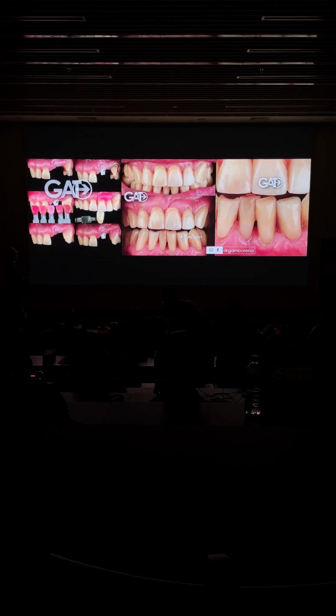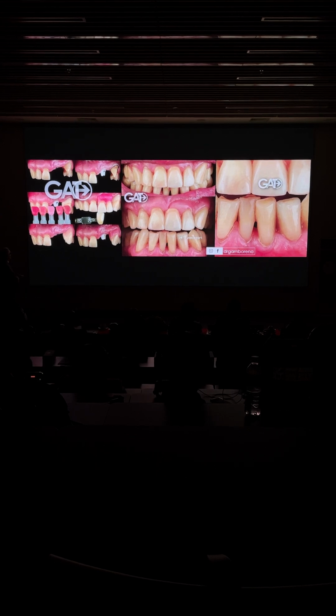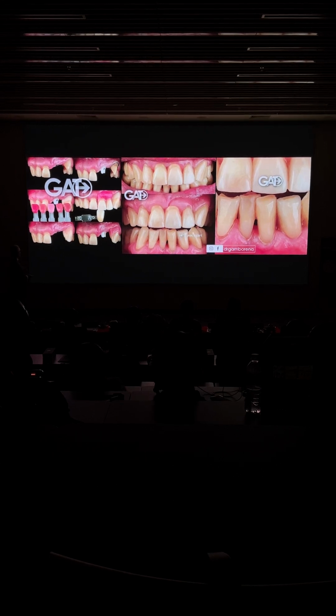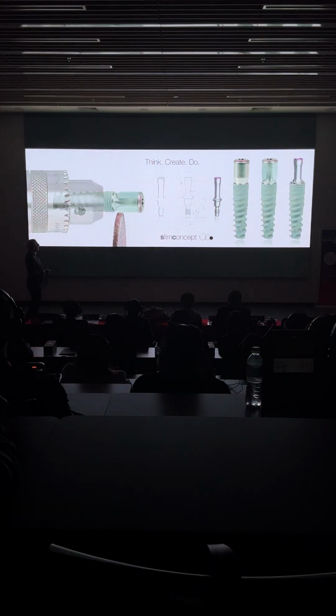We did some composite, a hybrid crown. Instead of extruding and making his life more miserable, we did the crown with some composite and did some guided clasps, less removable, and he was a happy camper.